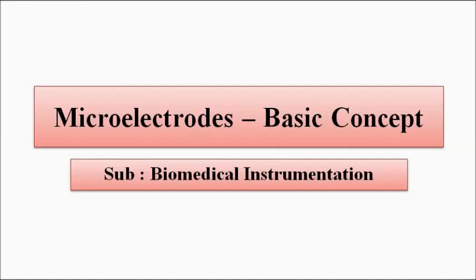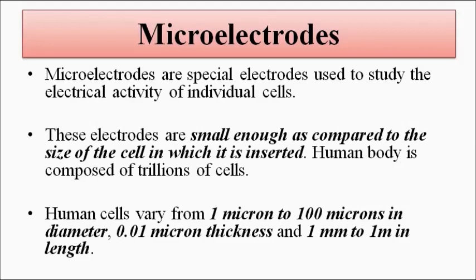So today we are going to discuss another important electrode, which is called microelectrodes. Okay. So what are these microelectrodes?